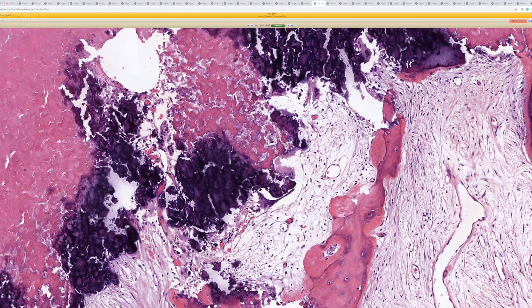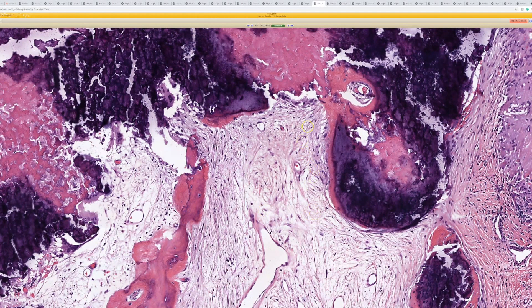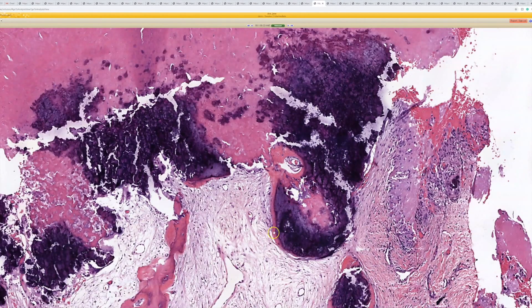That's the way to tell apart, say, osteoma cutis, which is bone, from calcinosis cutis, which is just calcified debris. I feel like a lot of times people struggle with that, and that's the way to tell them apart.